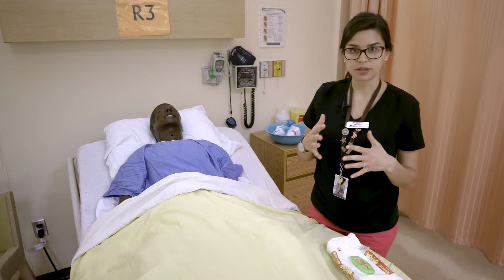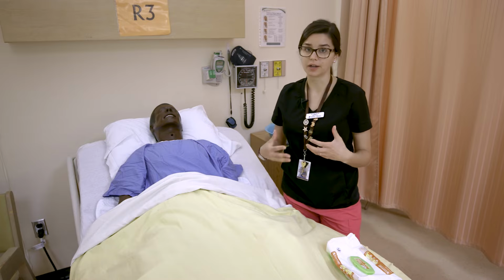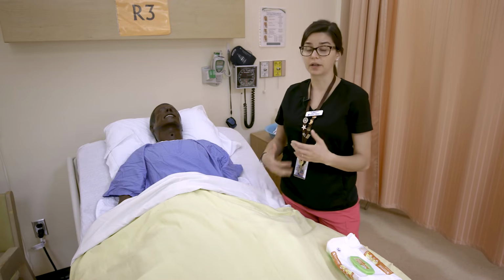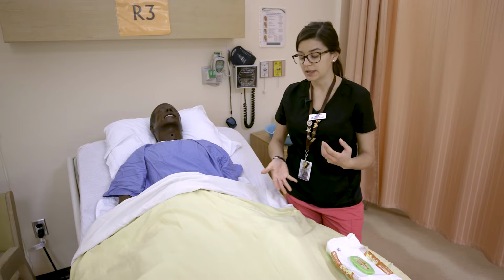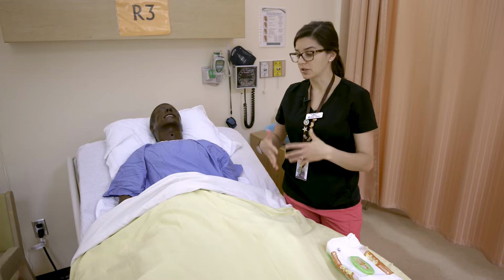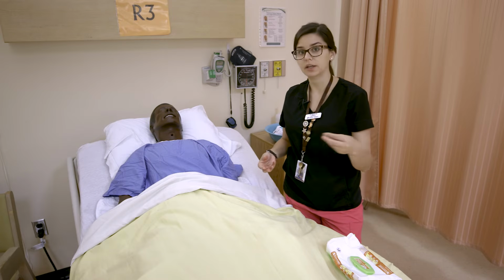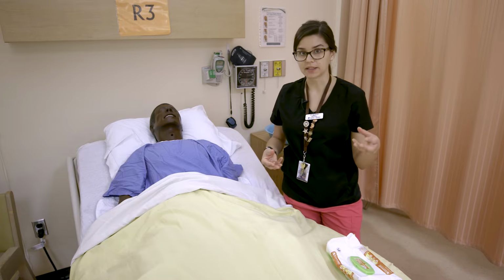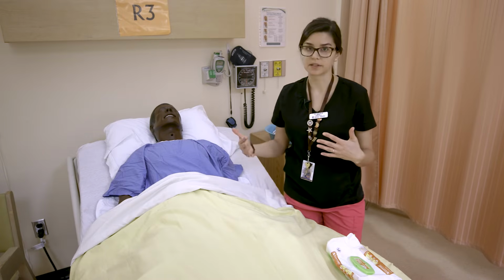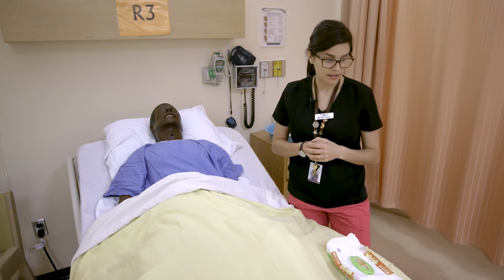You want to make sure, especially with a client with an indwelling foley, that you're doing peri-care often, so at the very least BID and then of course PRN throughout the day if they are, say for example, incontinent of stool, or if they have excess discharge or mucus that kind of collects on the catheter, because as you can probably imagine, that tube puts them at high risk for infection if germs and microorganisms can sort of crawl up, or move up into their bladder.